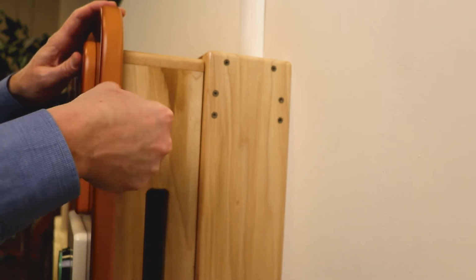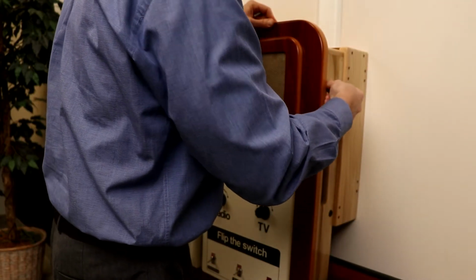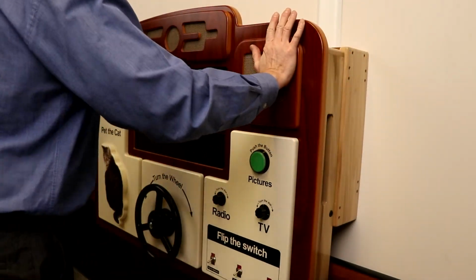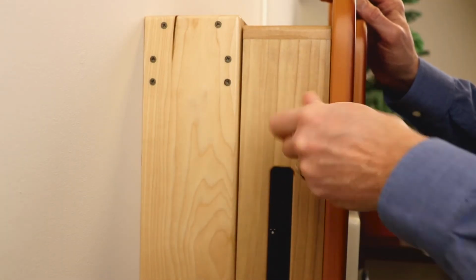Once you remove the bolts, put them in a safe place for now, as you'll need them to close Abbey back up. And now, let's remove the top left bolt, being mindful to hold the front panel so that it doesn't fall open and jar the components inside.